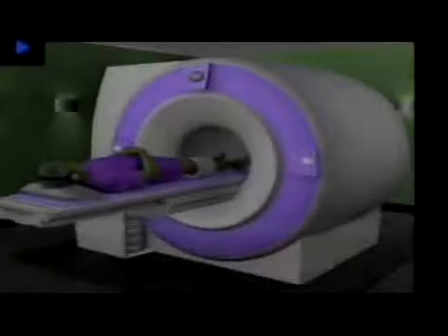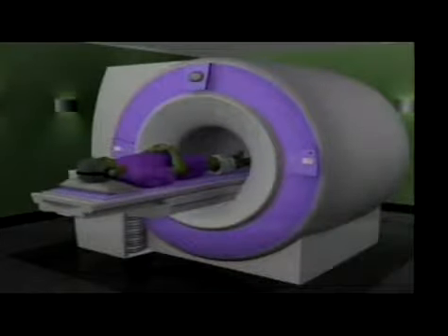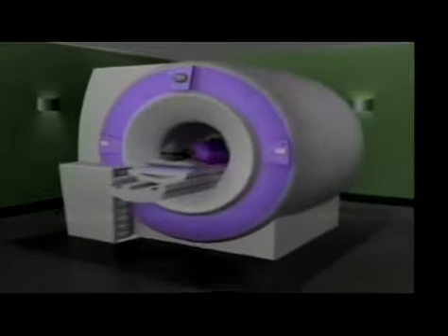And so this image will be an MRI? Correct. We use something called the magnetic resonance imagery. A patient goes into this tube, a magnetic resonance imagery scan, and you'll scan the patient's hip, and then the patient's knee. So those are the MRI images on the right. Correct. And then the patient's ankle.